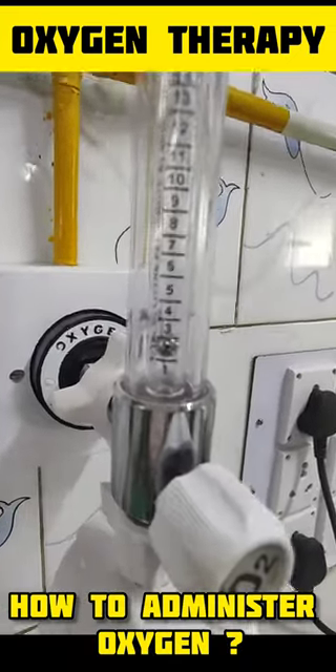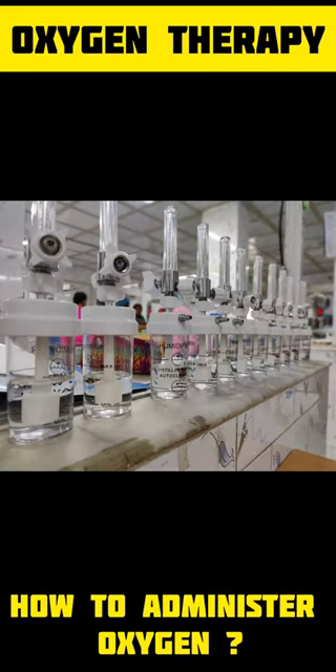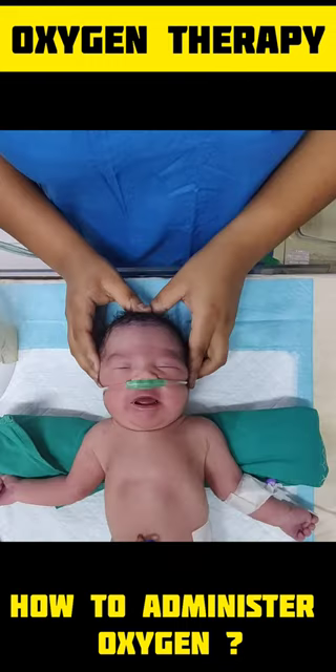Ideally, a pulse oximeter should be used to monitor oxygen saturation. Nasal prongs and head box are useful means of delivering oxygen to a neonate.